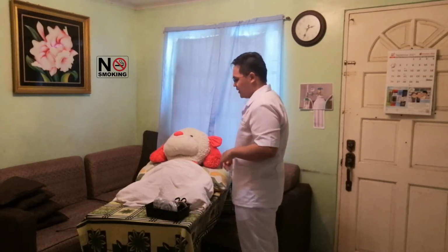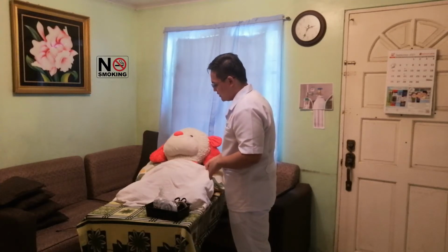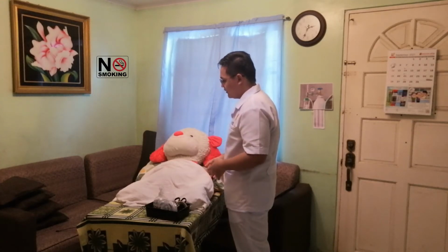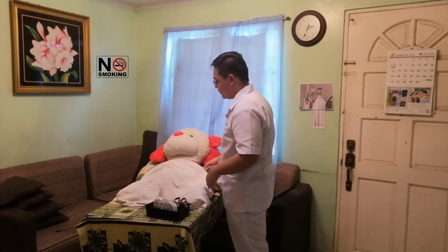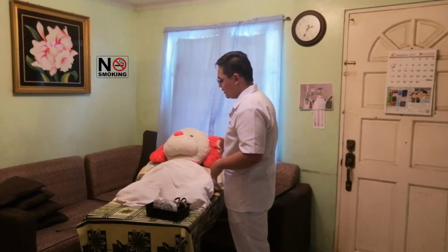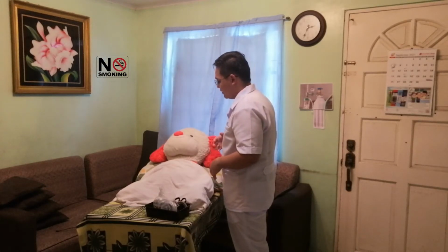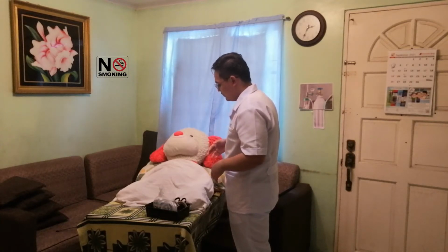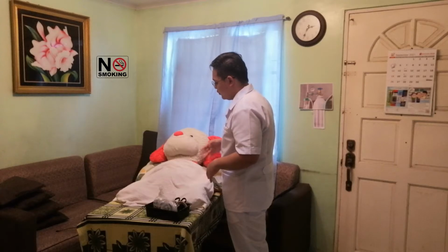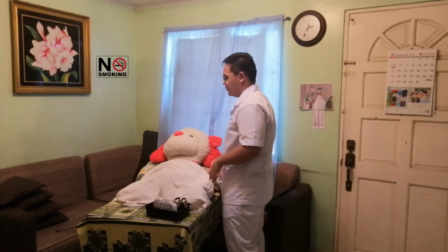So for today po ma'am, magkakanda po tayo ng oxygen therapy. So it is very important po for people who need respiratory help po. So this would increase po yung atin pong airway for our breathing. So this is usually conducted po for people who have difficulty of breathing. Okay po? Okay, thank you po.